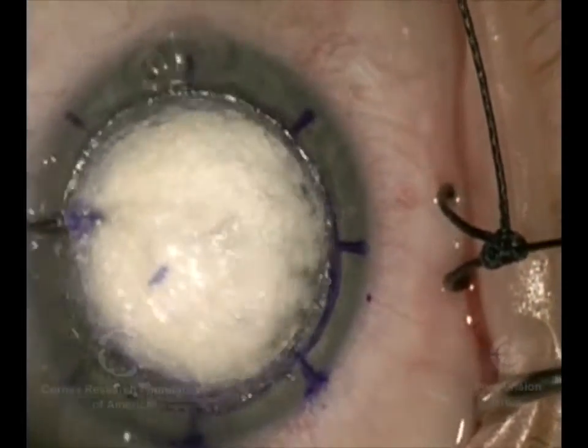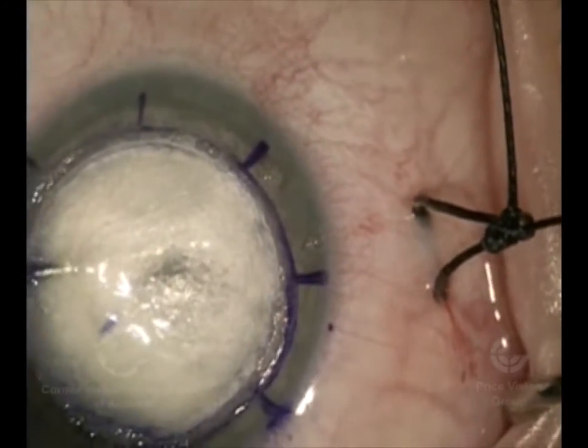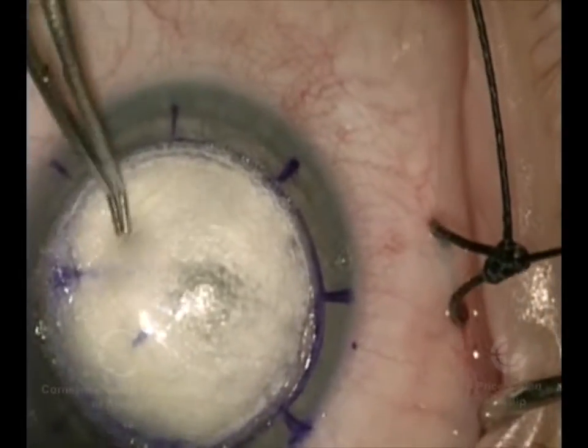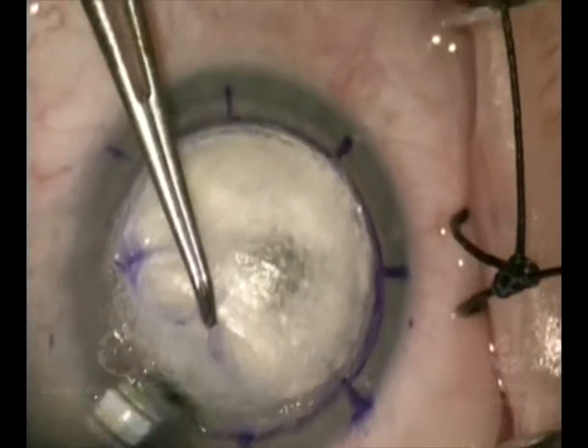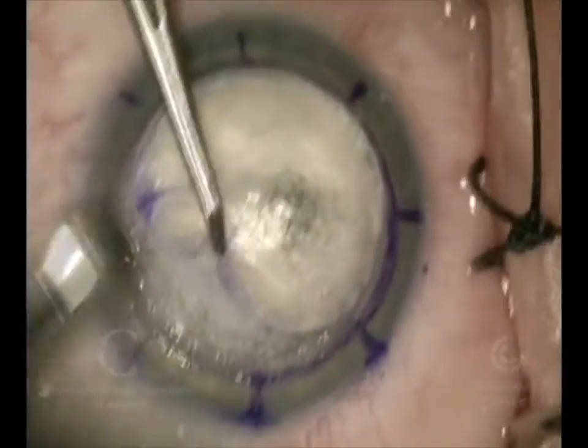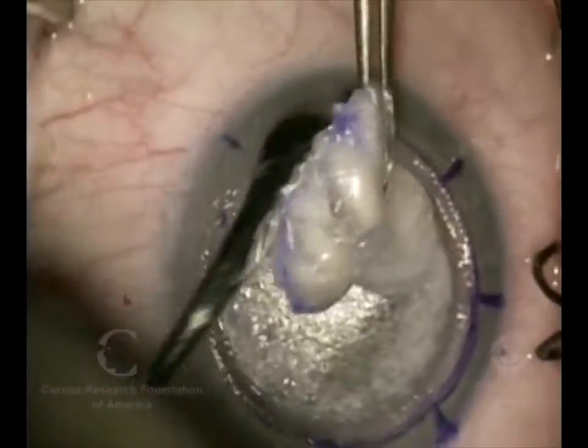The first injection didn't detach that membrane, but the second one did. When it did, you could see the bubbles go out more deeply in the tissue and out past the area where we put our reference marks. So now that we've created the detachment of Descemet's membrane, we're going to remove the anterior portion of the cornea.